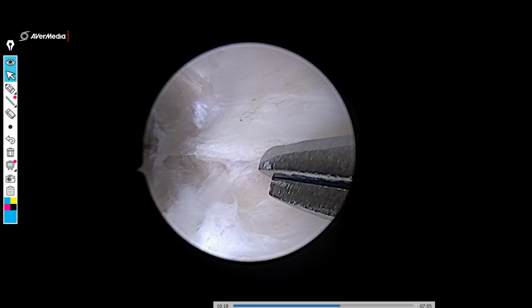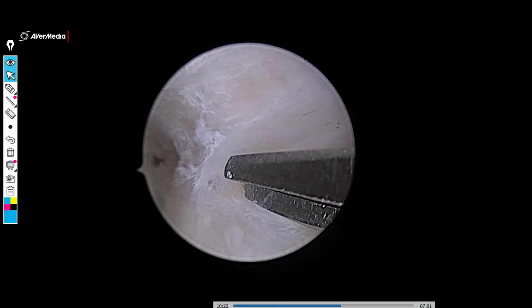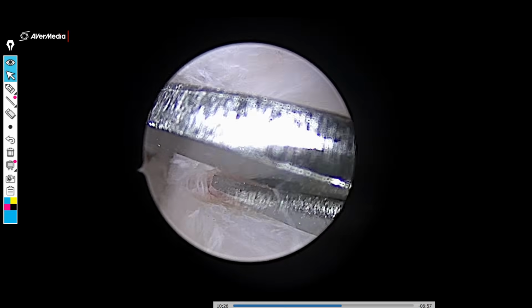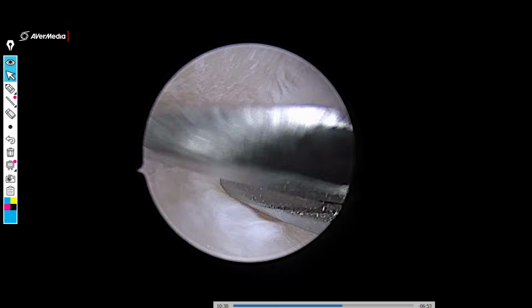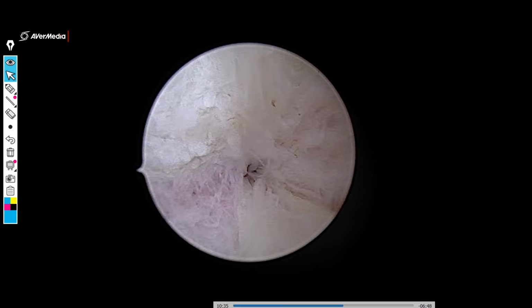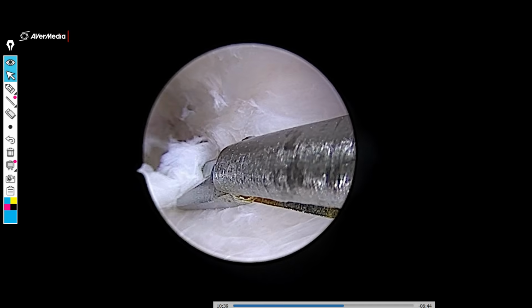They are also present sometimes on the lateral wall of the uterus. So, as we do a lateral metroplasty, we are going to use the hysteroscopic scissors to perform lateral wall synechiolysis in this particular case. So, you can see over here, we are cutting over the lateral wall, starting from the internal os and cutting all the way up to the ostium.